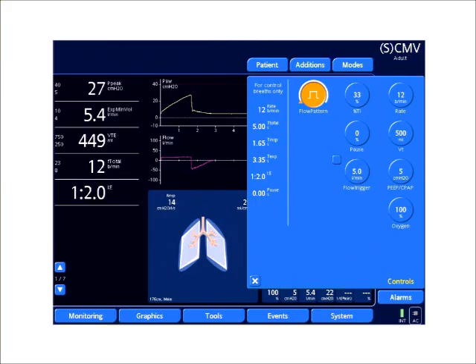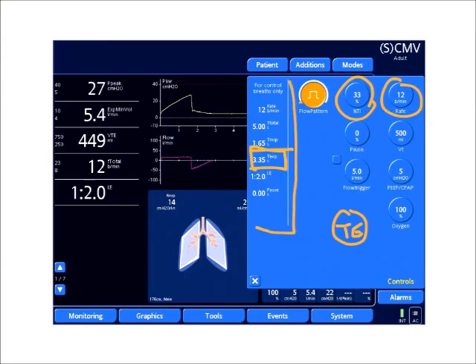Here's another example of a mechanical ventilator. This is a newer mechanical ventilator, and if you look through all the settings, you don't see a setting down here for expiratory time at all. So expiratory time is going to be determined by my frequency setting and my percent inspiratory time setting. Based on that, it will mathematically calculate inspiratory time, and left over will be expiratory time. So at least in this smart window here, it shows me what my inspiratory and expiratory times are.